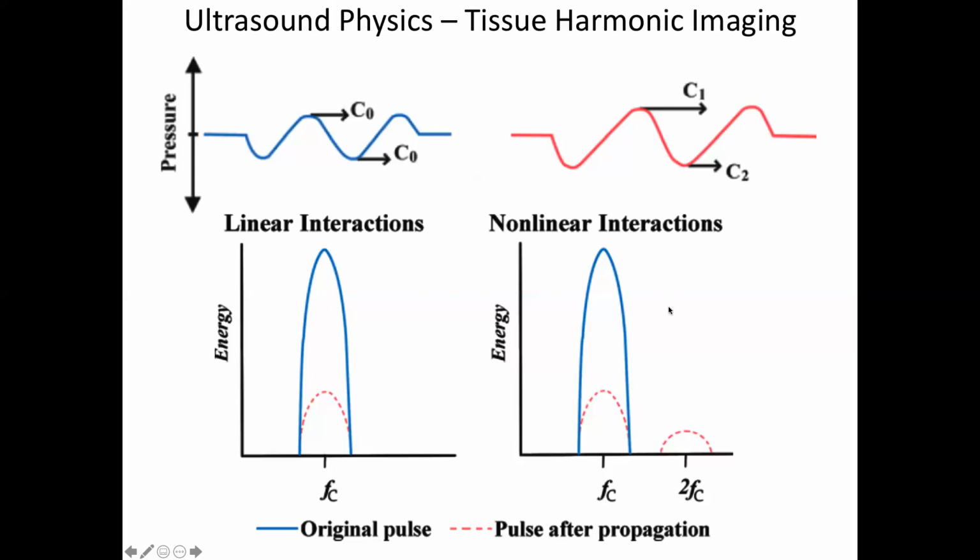Initially it was probably discovered and people said, well, that's just an artifact. We're going to have to deal with this artifact. We have these extra components as opposed to our primary, which is obviously the one we want. And in imaging, it's always the same: one person's artifact is another person's technique. If you have artifacts in your picture, you should always try to figure out how to make that signal useful, how to isolate something with that signal, or produce an image that is only that signal. That's a classic one, right?